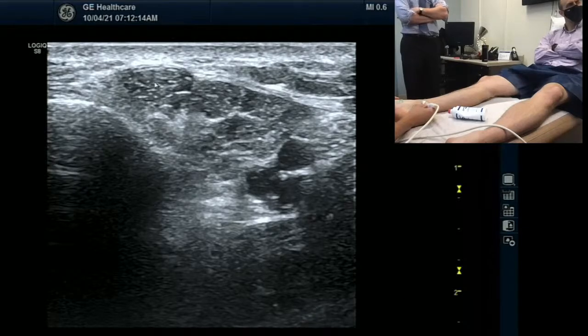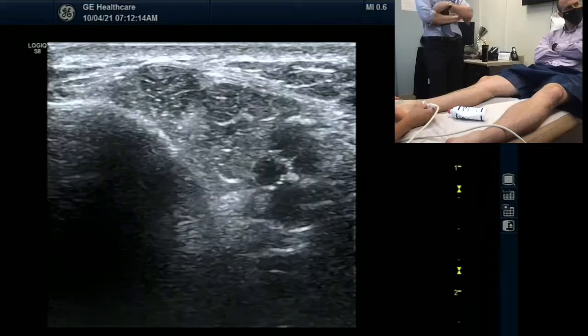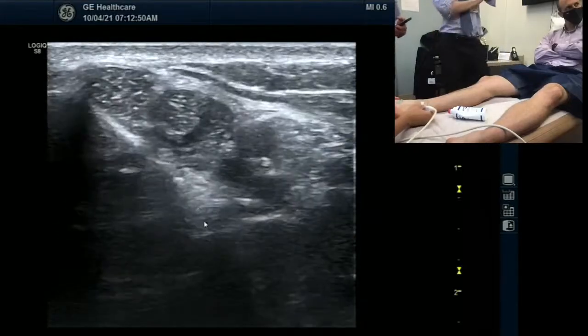This is the posterior tibialis. This is the flexor digitorum longus. This must be artery. But the nerve is in between the flexor digitorum longus and hallucis. Hallucis must be here. Hallucis is inferior. Longus is here. So deep. This is very tricky. I think the nerve is more on the right side of the screen. The nerve is on the top right.